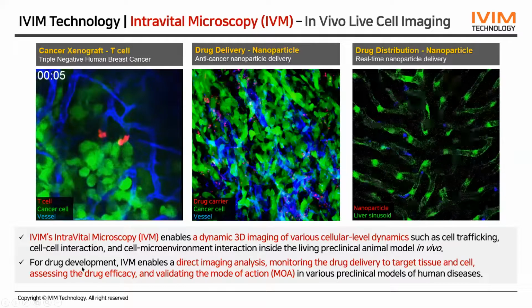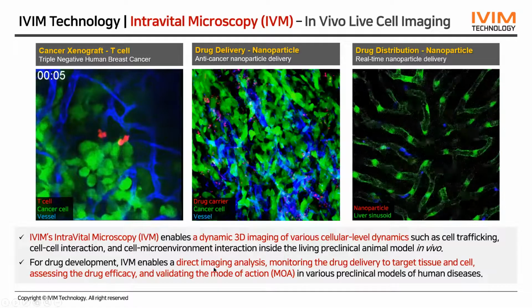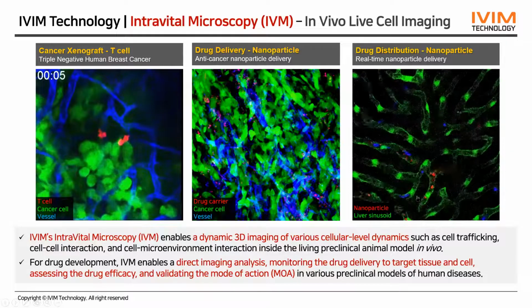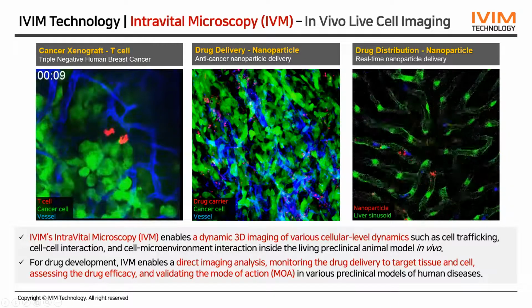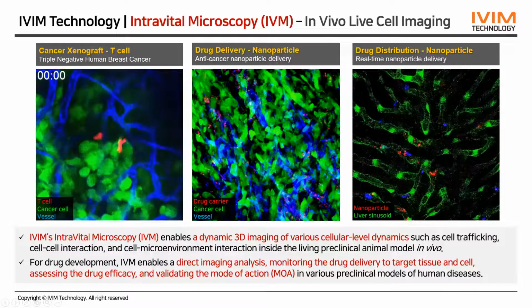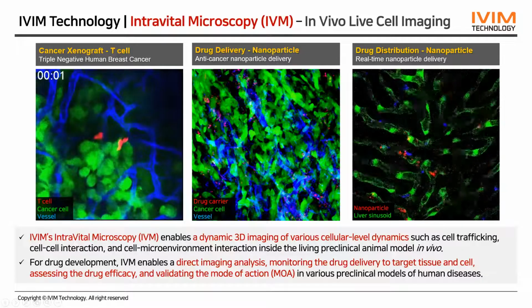Also, for drug development, IntraVital microscopy can enable direct imaging analysis for monitoring drug delivery to the target tissue and cell, as shown in the middle. You can see this red drug is delivered to the green cancer cells through the blue blood vessels.